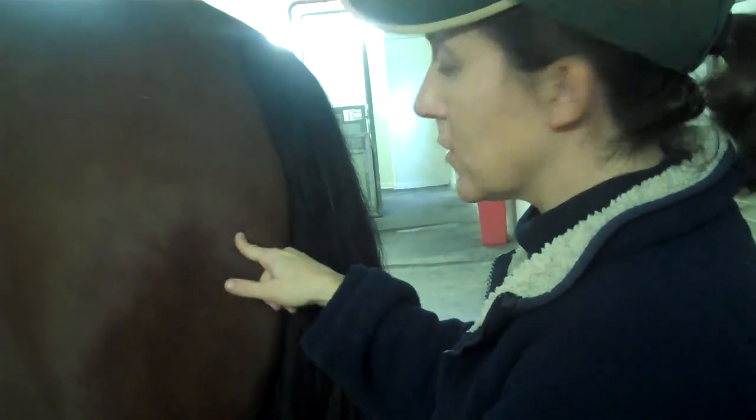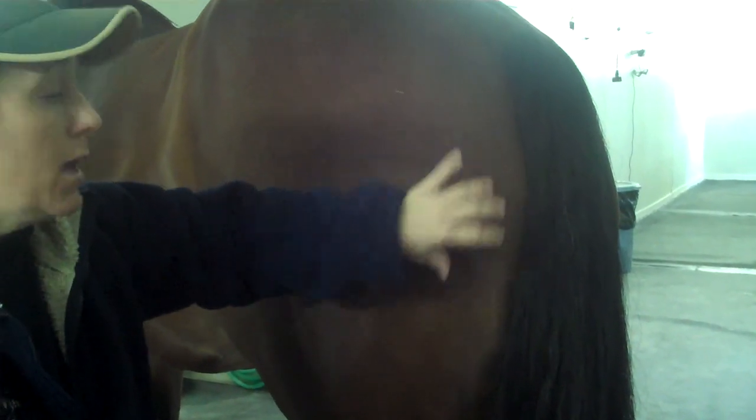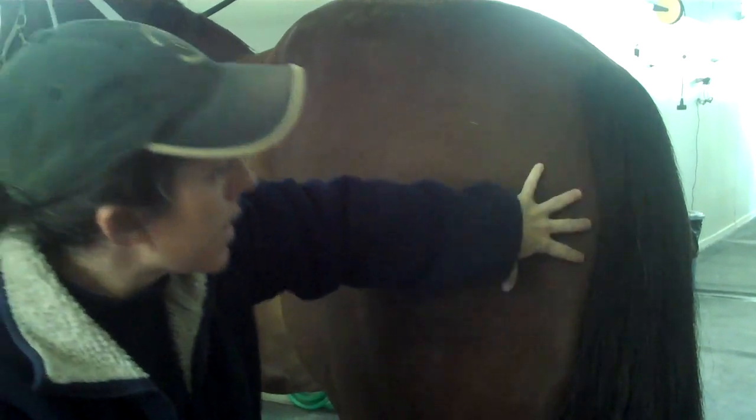If you want to give a shot in the back end, the horse has two nice muscle bellies on each side of the tail head. Down the middle runs a vein and a nerve, so you want to miss that. Usually I'll stand on the opposite side of where I'm giving the shot — that way if the horse kicks, you're out of range. I'll take the needle off the syringe and put just the needle in first. When I know the horse is being good, I attach the syringe, pull back for blood, and if there's no blood, give the shot. Down low on either side of the tail head is the best place — if it abscesses, there's a great place for it to drain.